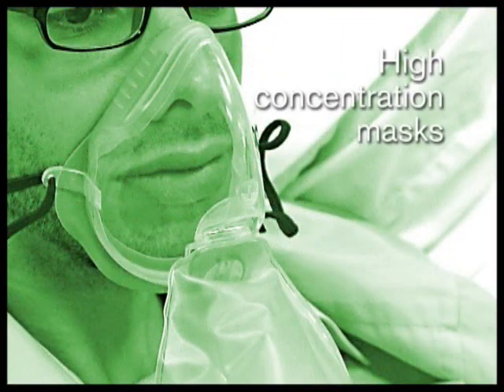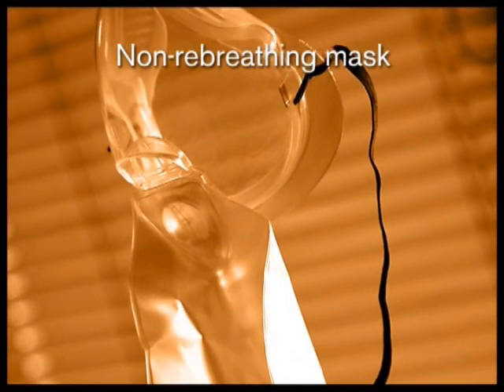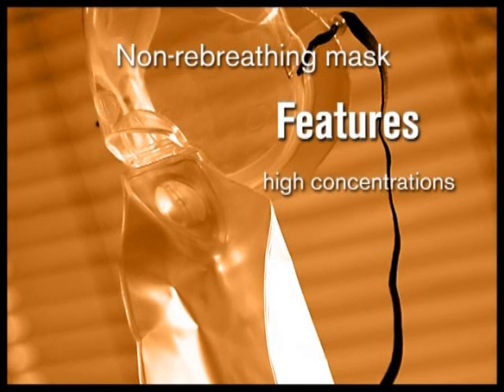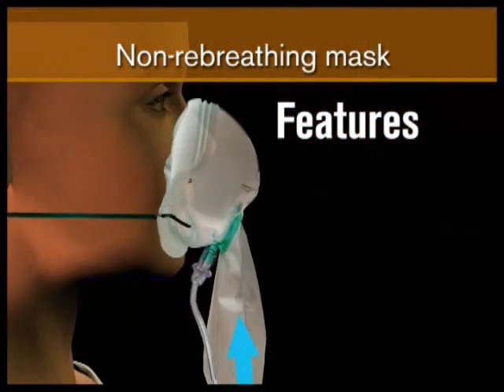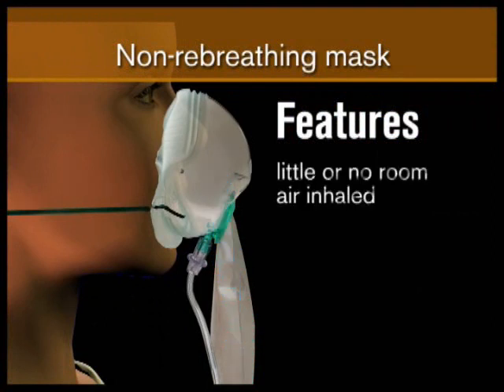High concentration masks. Non-rebreathing mask. This mask is usually used when high concentrations of oxygen are required, for example, with the critically ill or unstable patient. The patient breathes from the mask and the inspiratory valve opens so that oxygen is taken from the reservoir bag and the patient does not breathe room air.